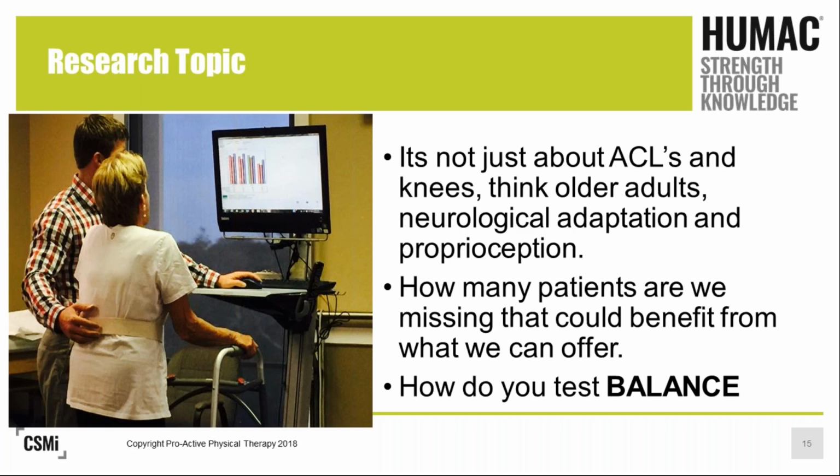And so with that, I'm going to throw this to you. How do you guys test balance? Or do you test balance? Almost all of us train balance, but do you test? Do you do a CTSIB test? Are there testing mechanisms that you have that are reproducible that you could give me that information back and forth for each month that we're doing those tests? Because I think that's important to us also.